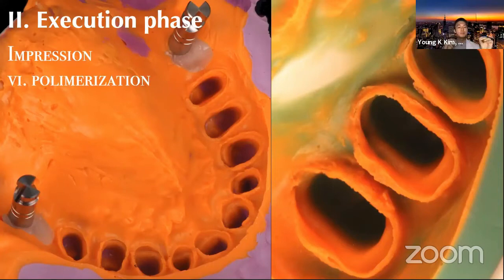And if there is a little bubble on the crown prep, it should be okay, because you're gonna do the die spacer anyways. And if the pocket depth's not more than 3 millimeters, I personally prefer to take both cords out and then blow air on the impression, so that it can surround all the way to the subgingival architecture of the tissue, so that when we pour up the cast, we have the full dynamics of the subgingival area so that the lab technician can have a better grasp when they're doing the wax-up for the final processes. So that's my personal preference.